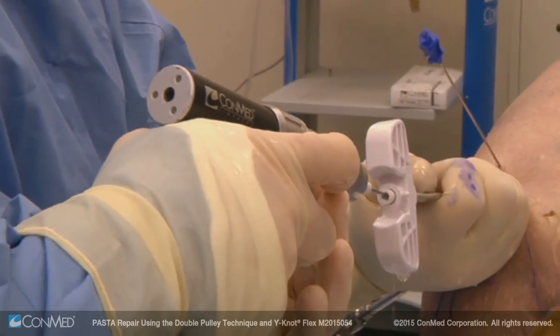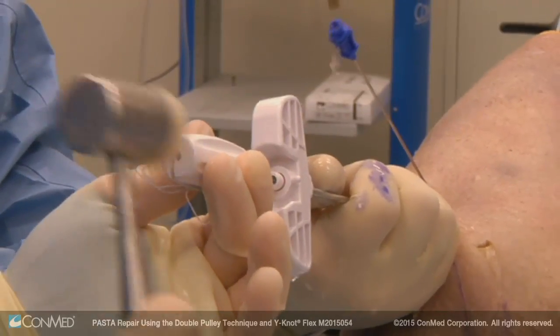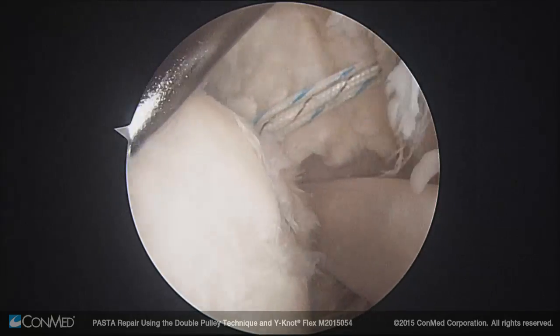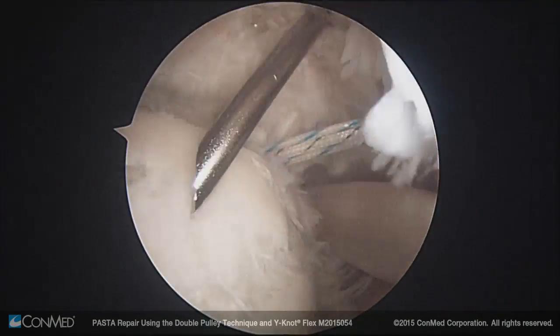After drilling the pilot hole with the 1.8 millimeter drill bit, the Y knot flex all suture anchor is inserted through the drill guide and into the bone using a mallet. The sutures are uncleated and the anchor is set by firmly pulling on all four strands of the suture until the anchor is set.